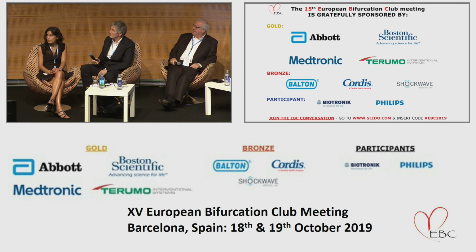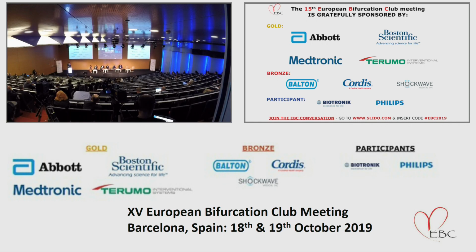SKS, we don't do that much. SKS is performed only in some kind of a true V configuration, not anymore, in an extremely unstable patient in order to save time. That's the only time we use SKS. Otherwise, we go with the nano crush or ultra mini crush, modified TAP, however you want to call the technique, or DK crush in some instances.